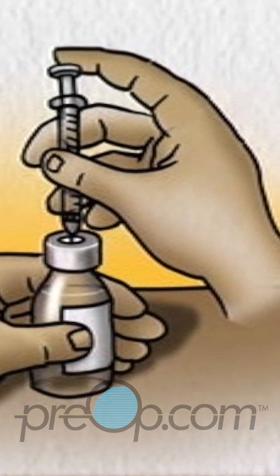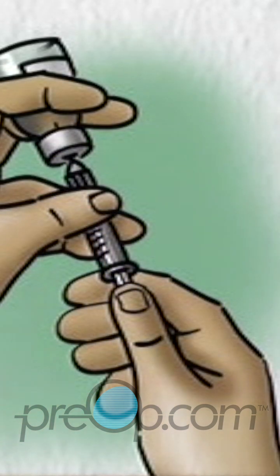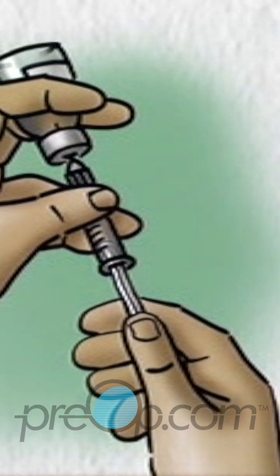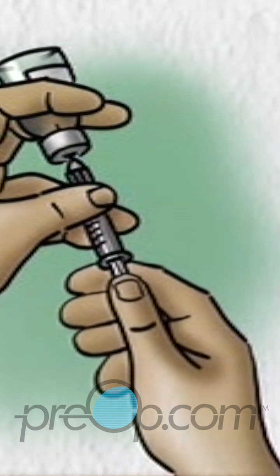Push the plunger down so that the air goes from the syringe into the bottle. Turn the bottle upside down so that the air in it is at the top. With the tip of the needle kept in the liquid, hold the plunger back to your dose. If any air bubbles are in the syringe, push the plunger back in and draw up the dose again.